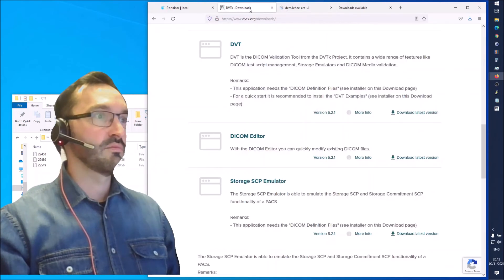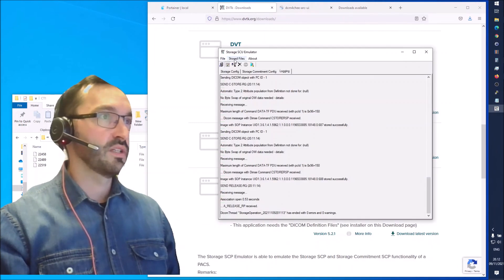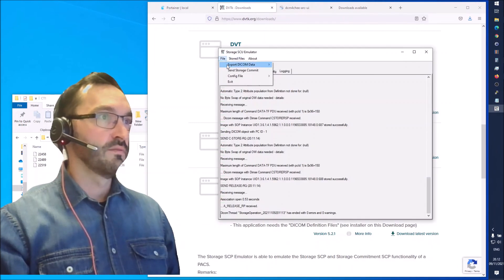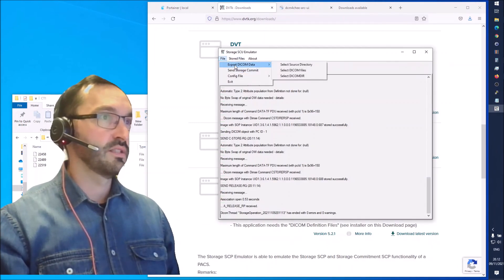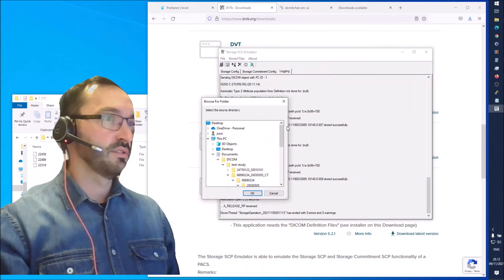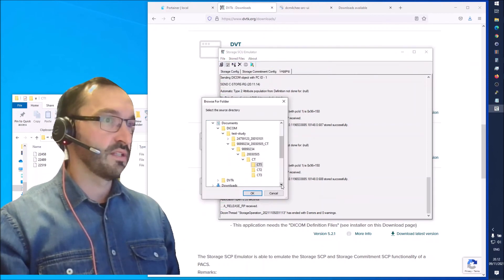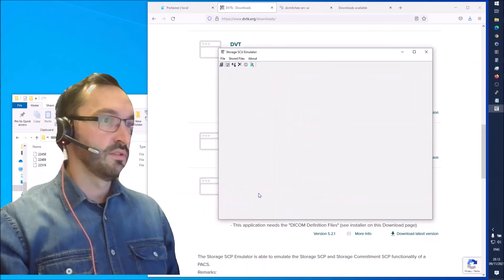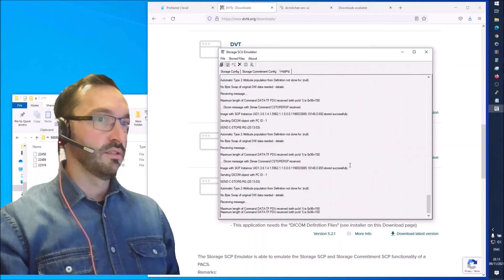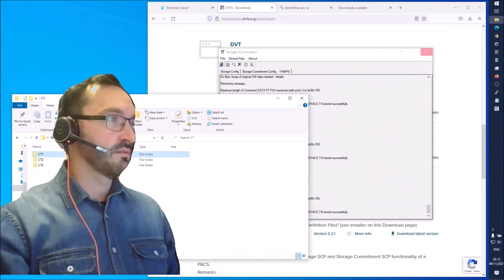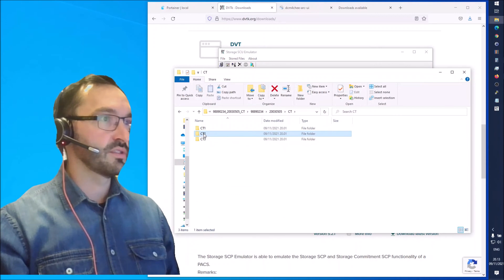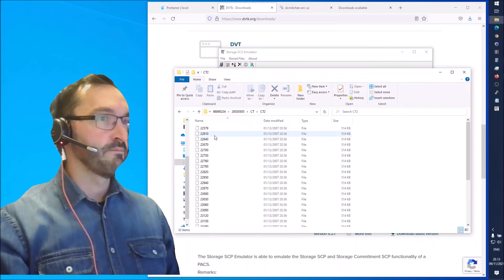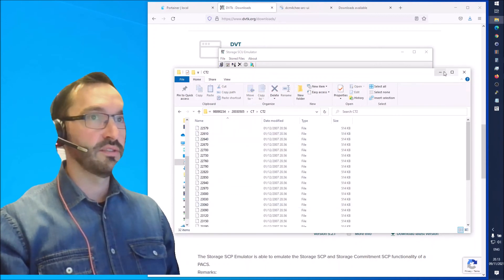Send some more images. We could go back to file, export DICOM data, select source directory. That second folder should have some more images. It's sending all of those files. Let's check how many objects it had.